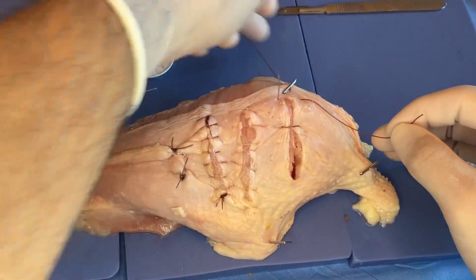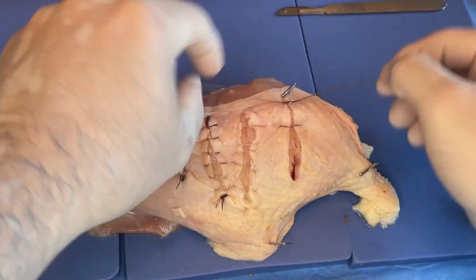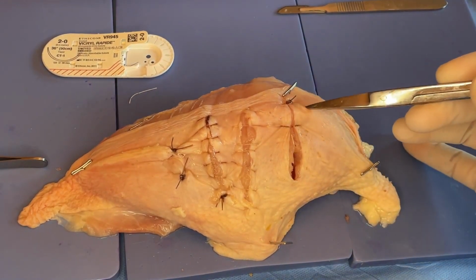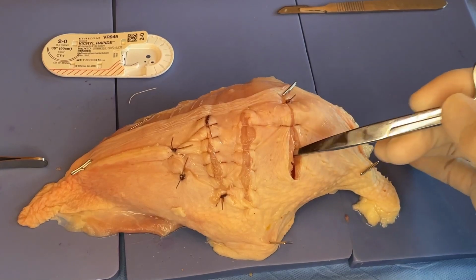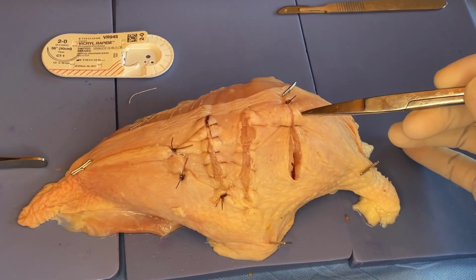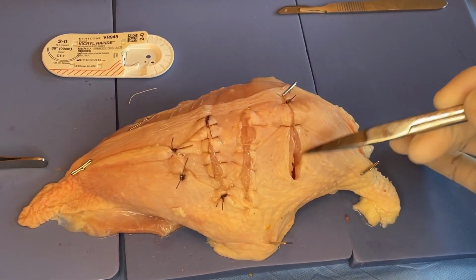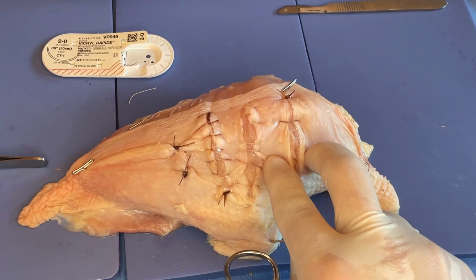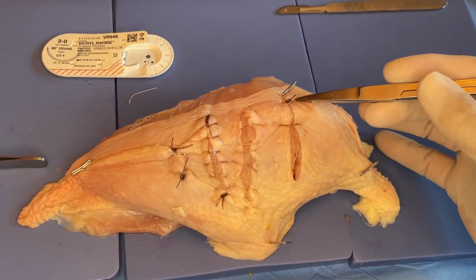And then we'll tie this, and again, I'm caught up on. What we're doing here is bringing the two edges of the defect together with our needle. The needle passed through tissue on this side, and then through tissue here. But because this is a bit more spread out, we've got to bite through healthy tissue, so to speak, and you can even go further back from the edge of tissue here than I did to create really quite large mattress sutures. When the needle is passing parallel to the defect, that's the horizontal mattress.